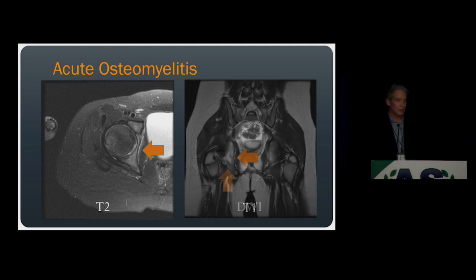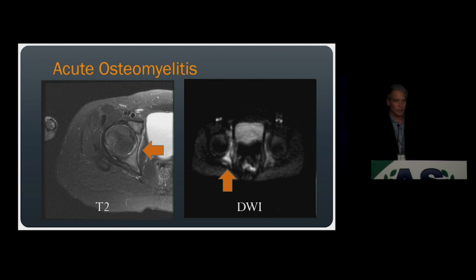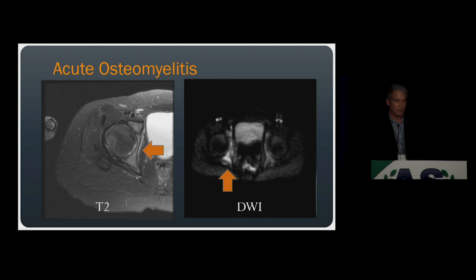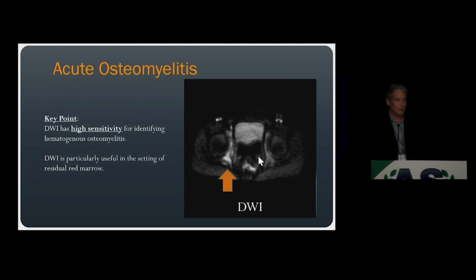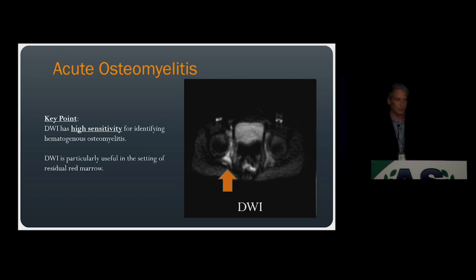This is where DWI is very helpful. On the diffusion-weighted image, we can clearly see increased signal within the right acetabulum in the area of periosteal edema, representing restricted diffusion consistent with hematogenous osteomyelitis. The next key point: DWI has high sensitivity — not specificity — for identifying hematogenous osteomyelitis, and it can be particularly useful for diagnosing it in the setting of residual red marrow, such as in pediatric patients or in imaging areas of large red marrow like the pelvis.